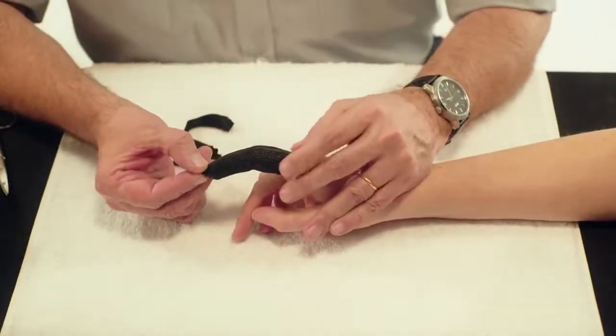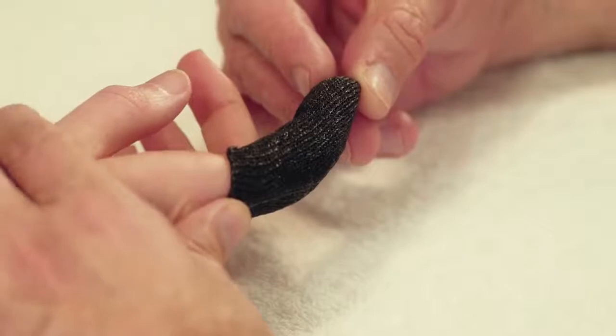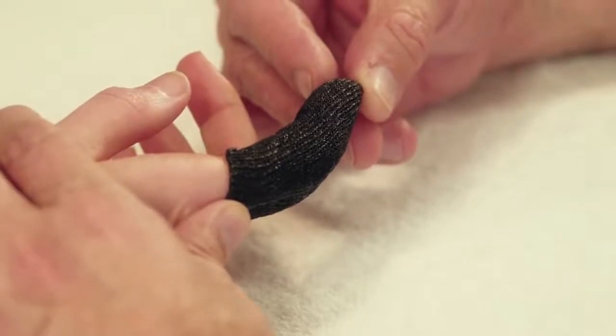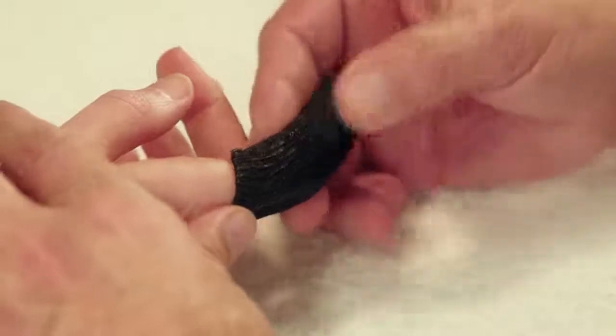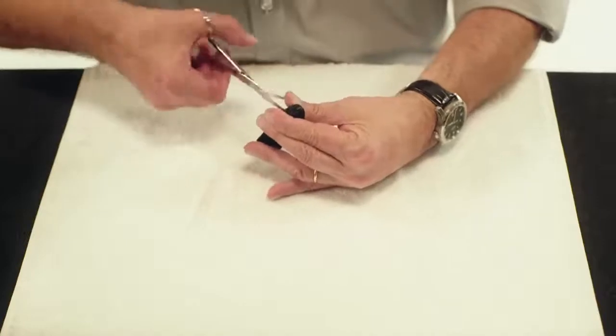When the orthosis has hardened, it can be removed and trimmed as desired. First, expose the entire nail.